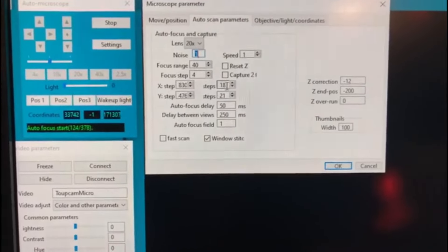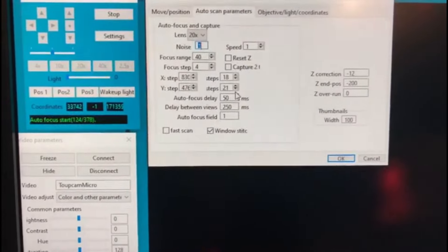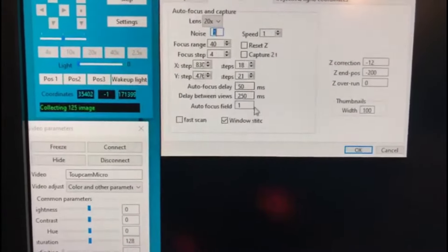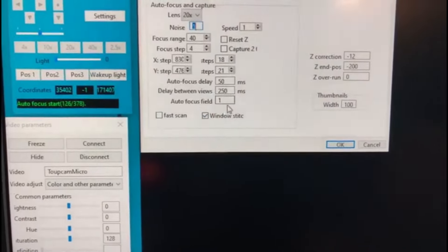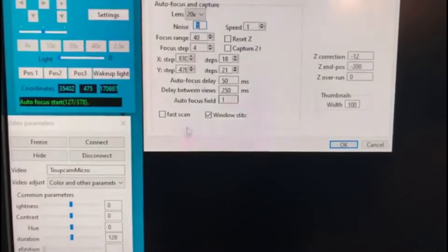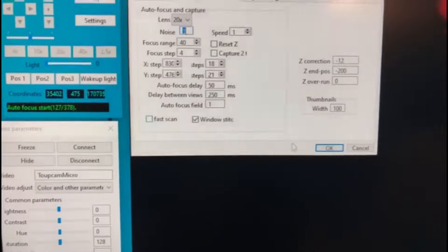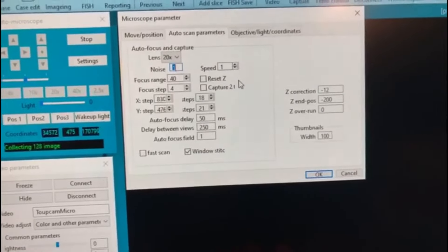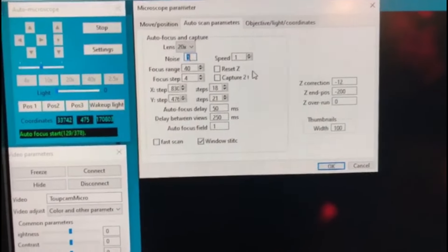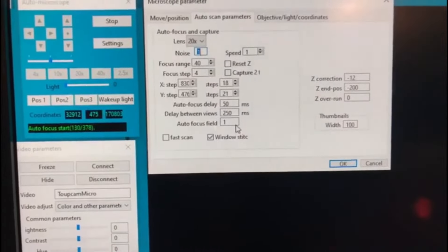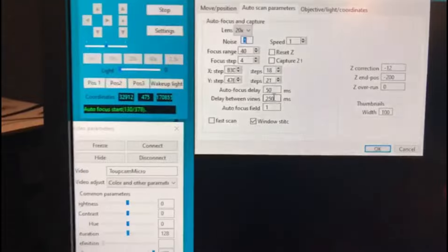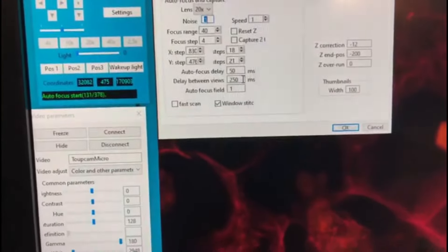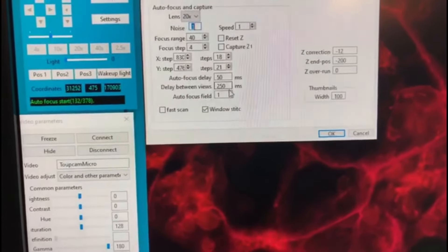We collect 18 by 21 tiles — 18 in the X direction and 21 tiles in the Y direction — to collect a big tiled image. We have defined focus for every single field of view, though we can skip that by clicking fast scan. We use a very slow speed of just one millimeter per second to make sure we collect every single focal point and don't miss any pixel.